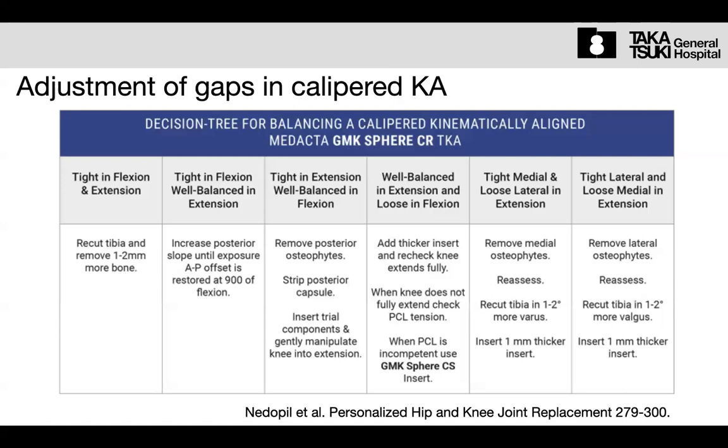Post extension. 結構これ強引に言ってるんだけども、無理やり伸ばせというふうなことを言ってます。ただ、theoretically, once we restore the patient native articular surface in terms of distal joint, and if we cut the tibia in the same thickness as the component thickness, pre-arthritic condition, the patient might be able to extend their knees fully.